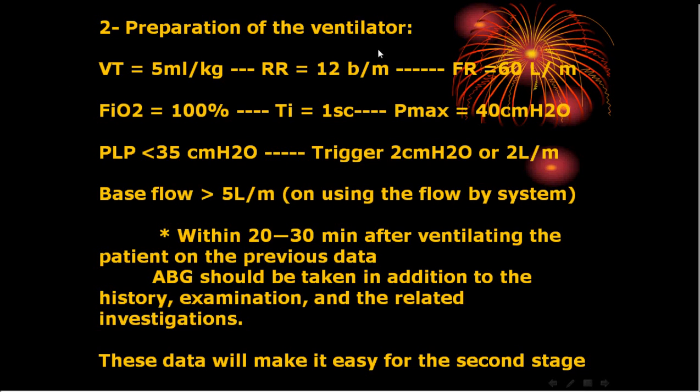Respiratory rate is low, not high, to guard against dynamic hyperinflation. And within 20 to 30 minutes after ventilation, you can take an ABG and take your data. This is the first one to take to start.